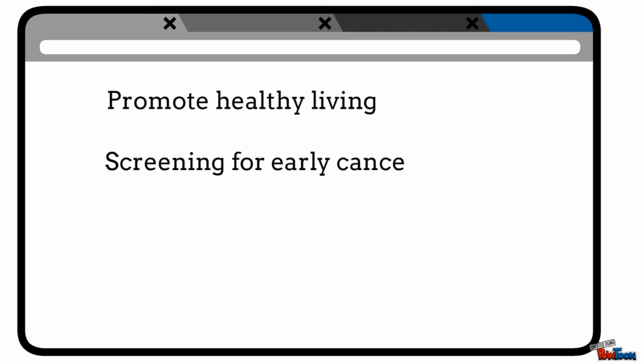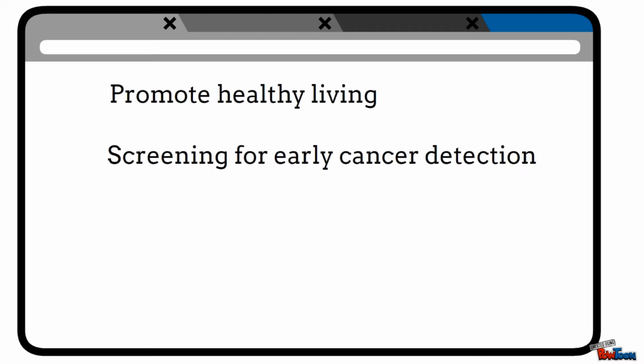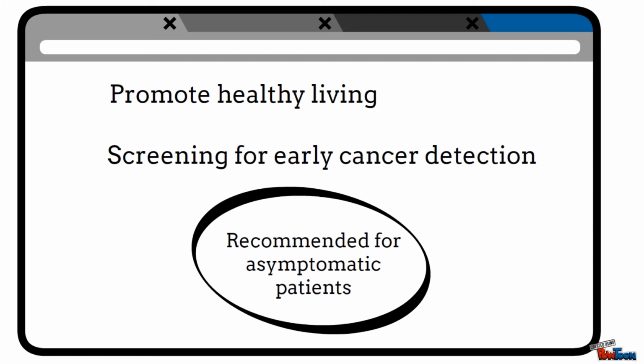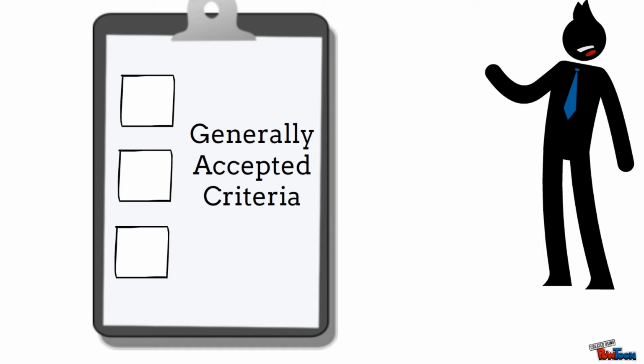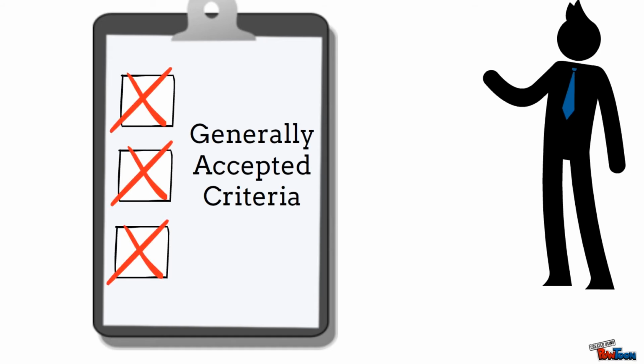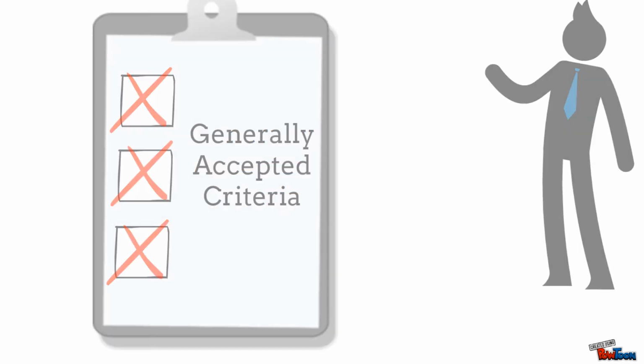Over the years, whole-body CT scanning has been advertised to promote healthy living and act as a screening method for early cancer detection. For this reason, marketing schemes mainly target asymptomatic patients, that is, patients who do not show any symptoms. Whole-body CT screening has not been demonstrated to meet generally accepted criteria for an effective screening procedure.